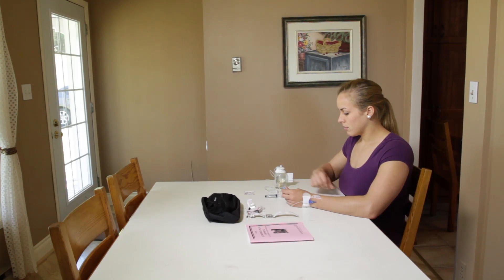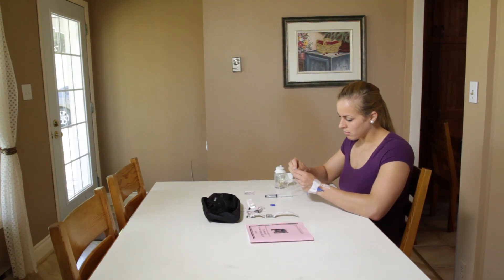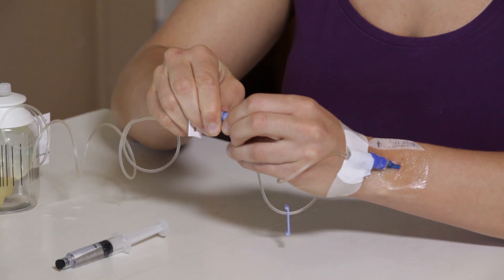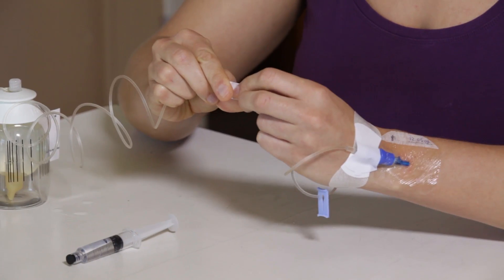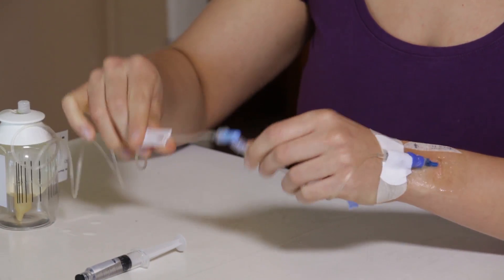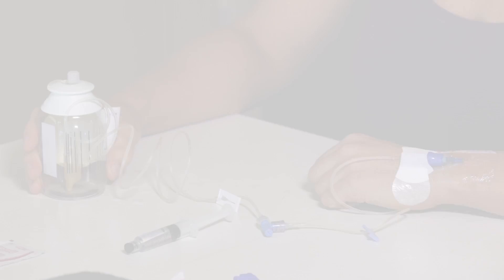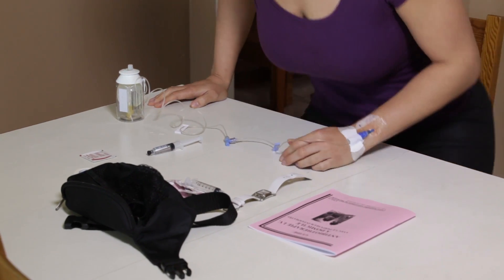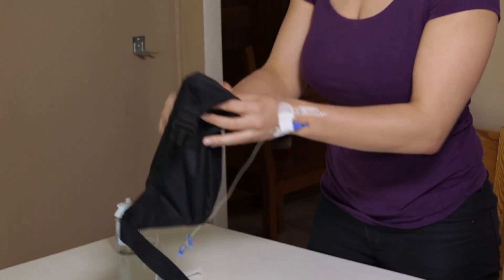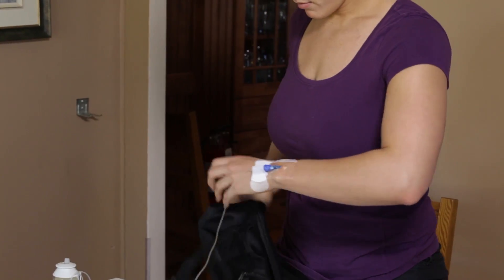Holding the catheter's extension tube, remove the protective cap on the infuser. Screw the infuser tubing into the extension tubing from the catheter without touching the ends. Open the tube clamp on the infuser so the antibiotics can flow. Place the infuser in your belt bag to protect it.